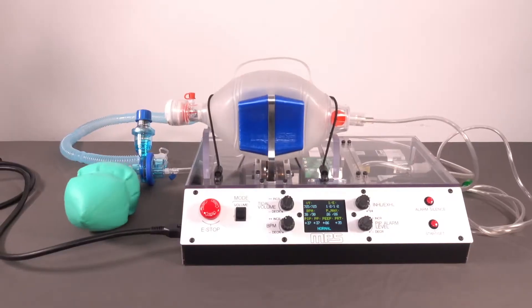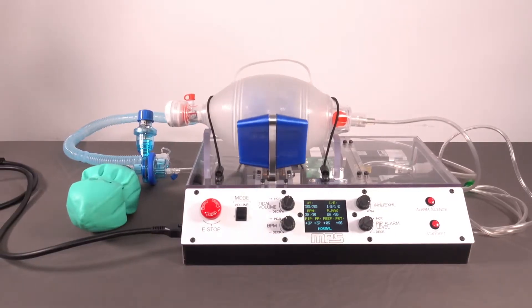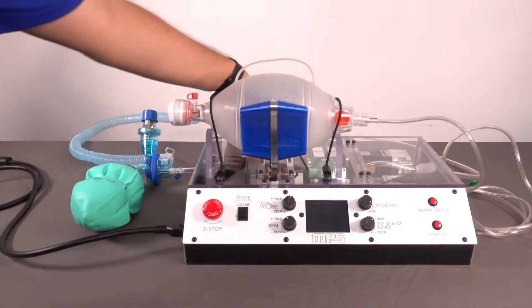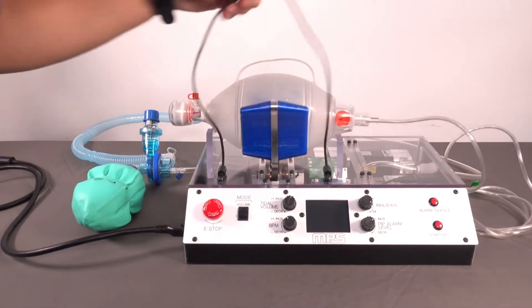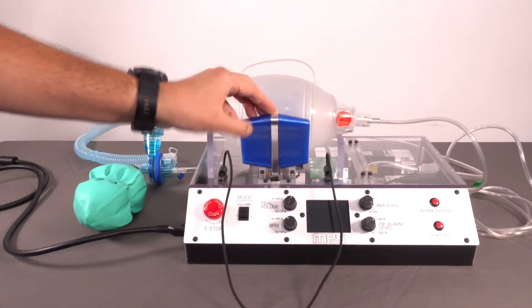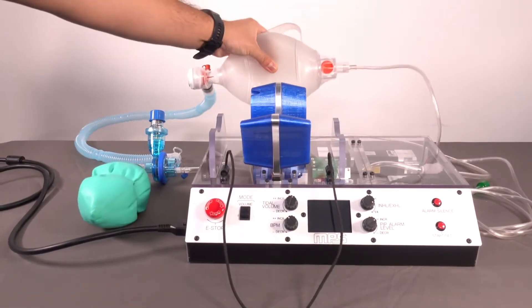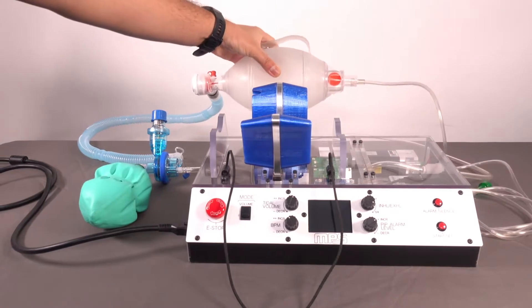The design utilizes an open top arrangement for easy placement and removal of the BVM to quickly transition between automated and manual actuation whenever necessary.